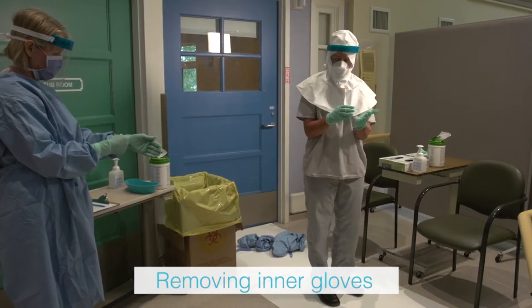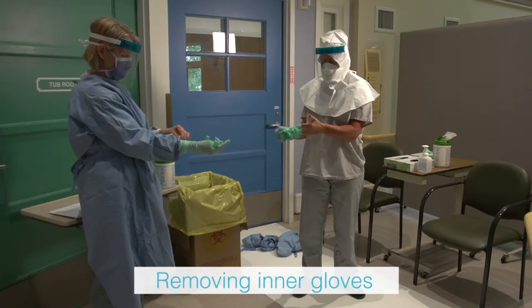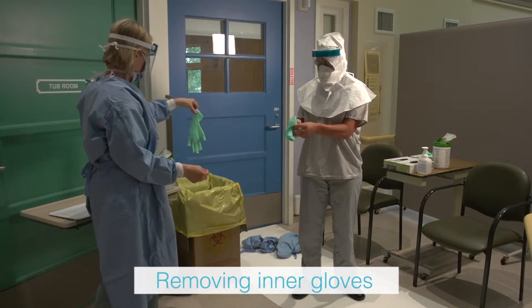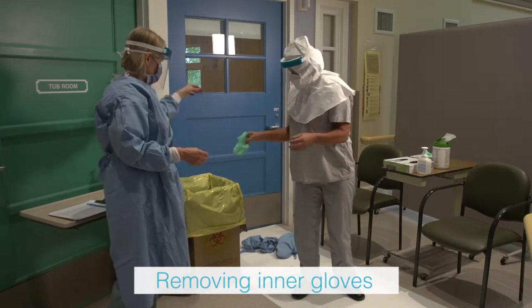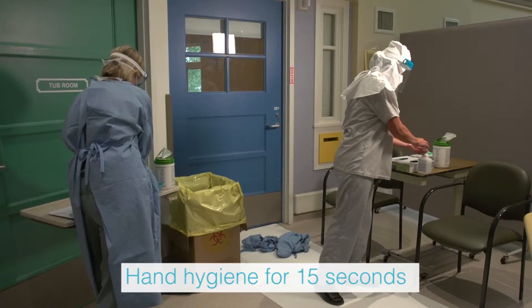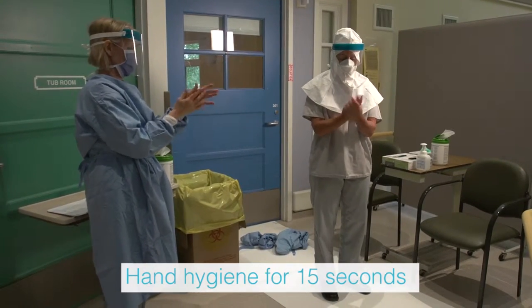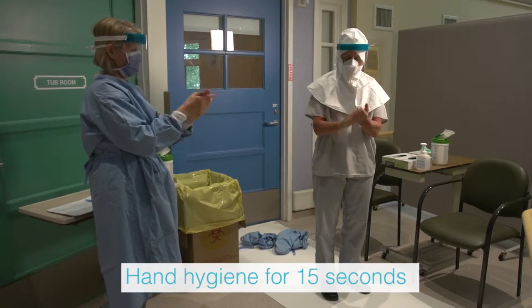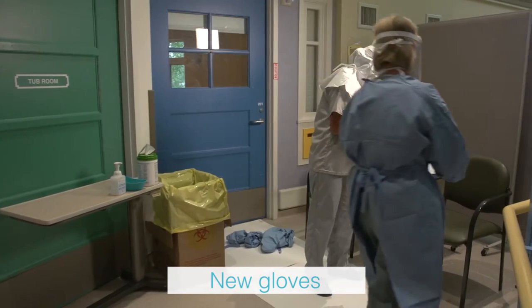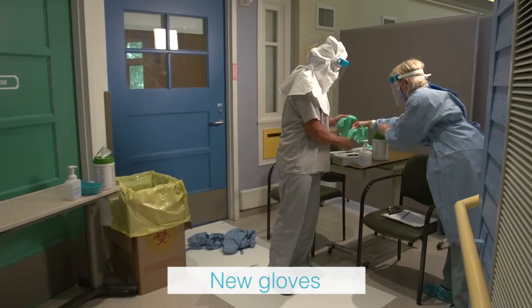The health care provider and trained observer remove the inner glove by grasping the outside edge near the wrist and peeling away, rolling the glove inside out. Slide one or two fingers under the wrist of the remaining glove and peel away. Discard immediately into the waste receptacle. Both the health care provider and trained observer perform hand hygiene using an alcohol-based hand rub and allow hands to dry completely. New gloves are then applied by both after hands have completely dried.